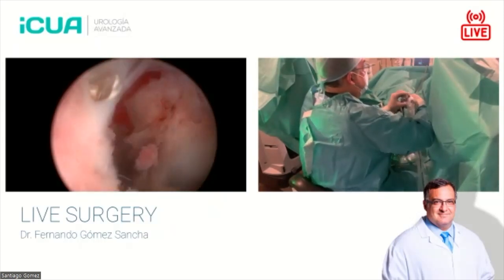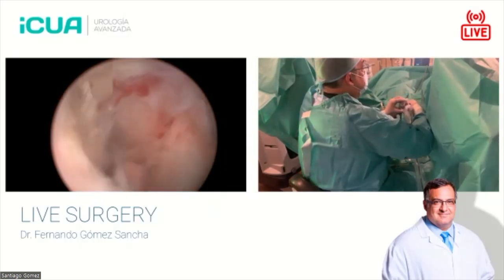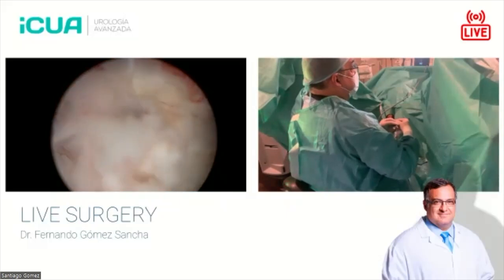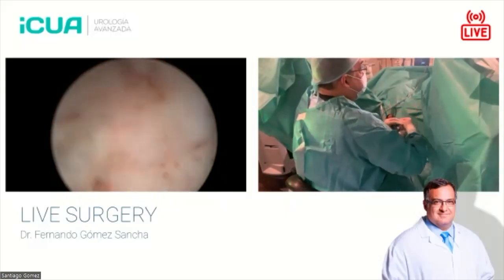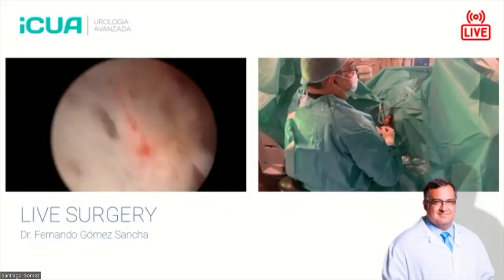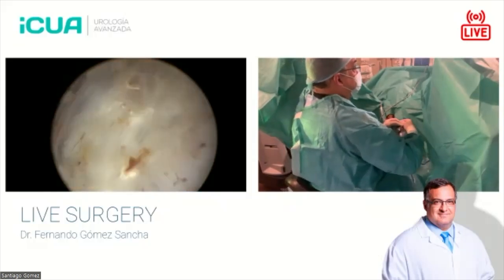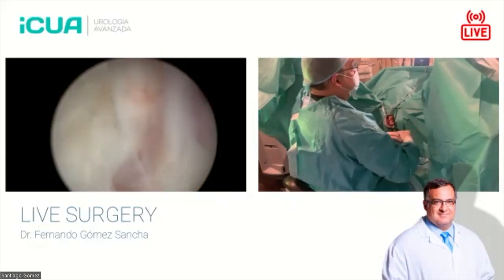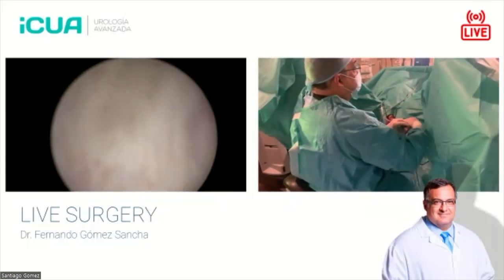But here we are at the apex. I'm trying to coagulate this little bleeder apically here. This is the white line, and I'm trying to follow this white line. You see now more horizontally, trying to get towards 12 o'clock to get some access again, and then to continue with the liberation of the lateral aspect.